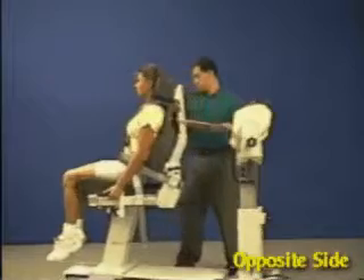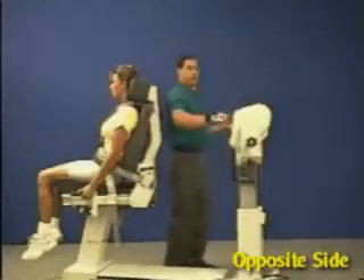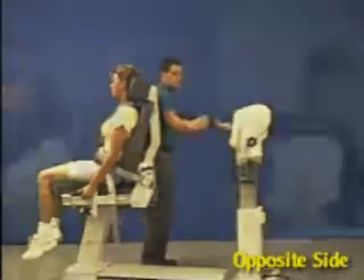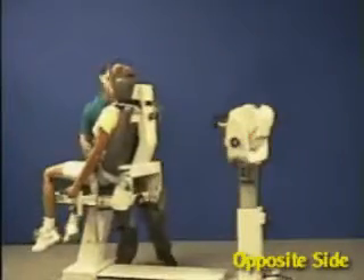For opposite side, move patient back. Remove shoulder attachment and rotate 180 degrees. Rotate dynamometer to opposite 10 degrees and chair to opposite 75 degrees.